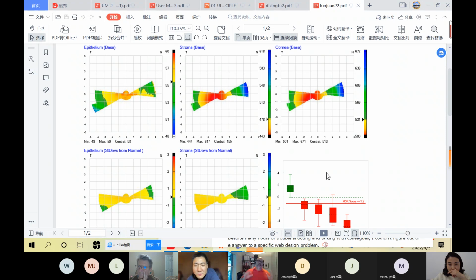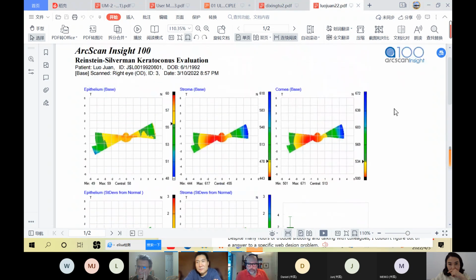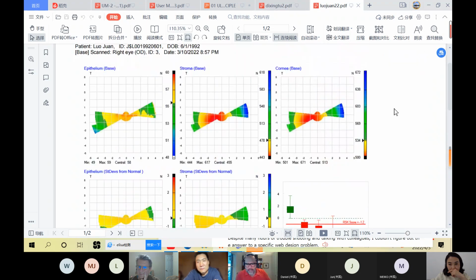Okay. Well, imagine if you open your eyes and I take a picture of your eyes, I will get a round picture if I see all the cornea. Now, if you squint, I'm going to have that. That is the difference between having the image like this or having the image like that. What you're seeing there is just the area of the cornea, of the epithelium that you could see, because everything else in white is behind the eyelids.